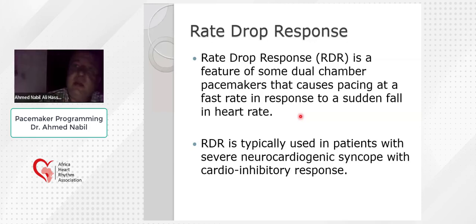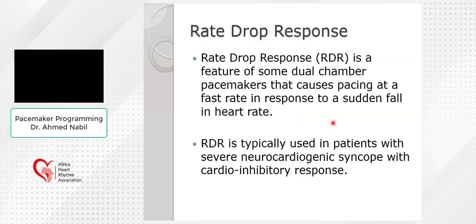cardioinhibitory response that have certain criteria can have a pacemaker, but it is very important that this pacemaker have this rate drop response, in which pacing at rapid rates is important because these patients have a sudden fall in their heart rates. The heart rate suddenly falls up to asystole. So these patients need a rapid pacing response that is present in pacemakers that have this option of the rate drop response.